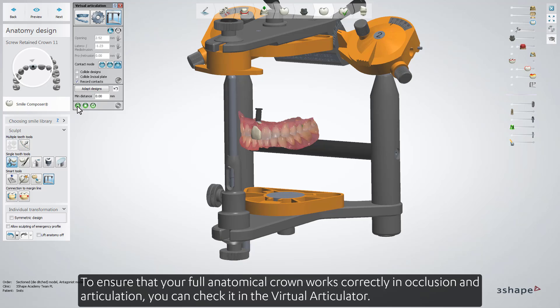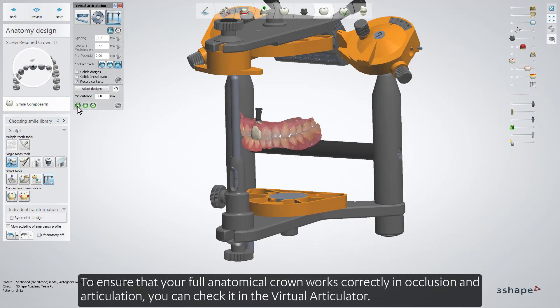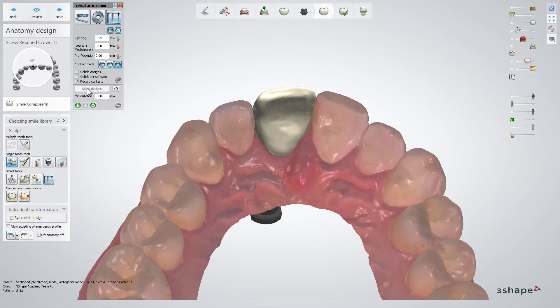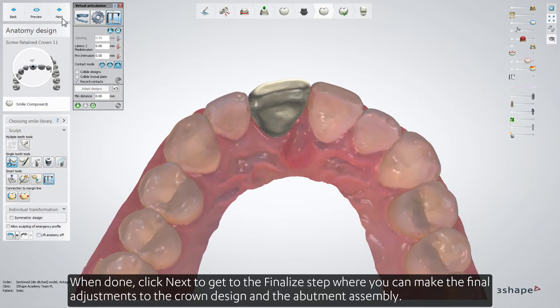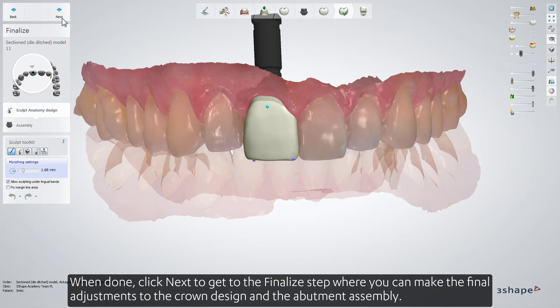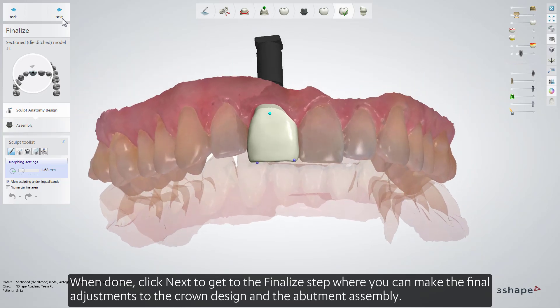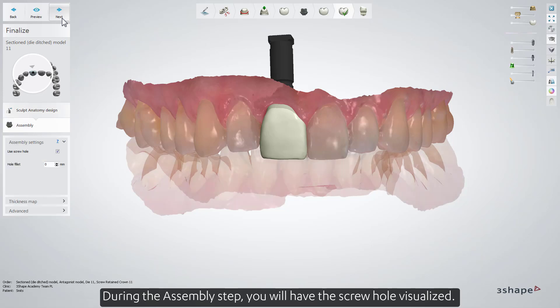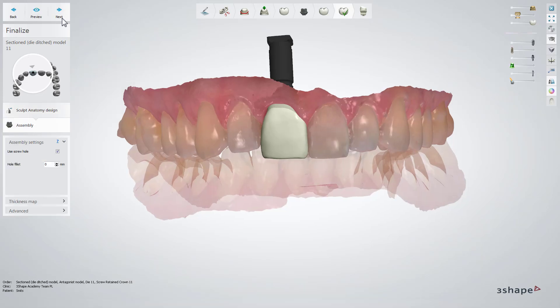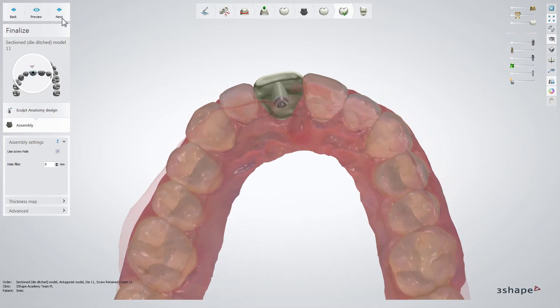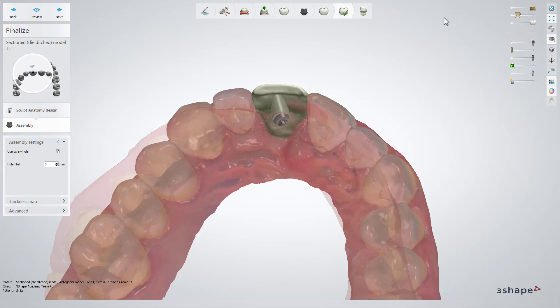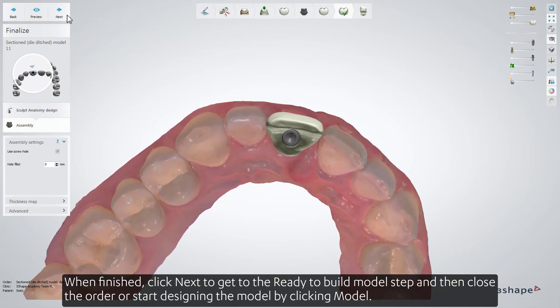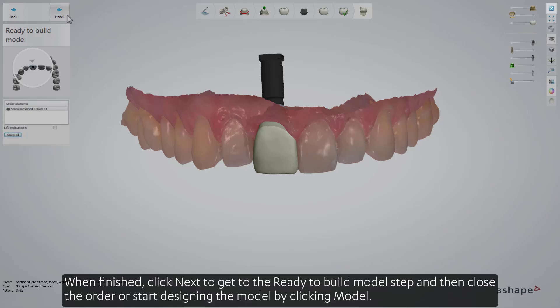To ensure that your full anatomical crown works correctly in occlusion and articulation, you can check it in the Virtual Articulator. When done, click Next to get to the finalized step, where you can make the final adjustments to the crown design and the abutment assembly. During the assembly step, you will have the screw hole visualized. When finished, click Next to get to the ready to build model step, and then close the order or start designing the model by clicking Model.